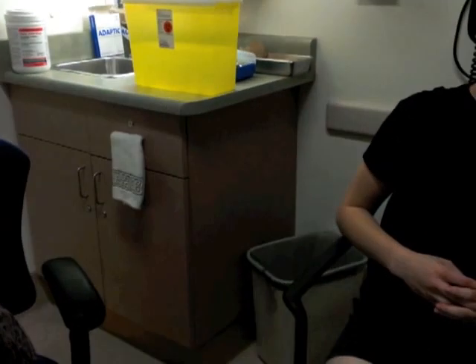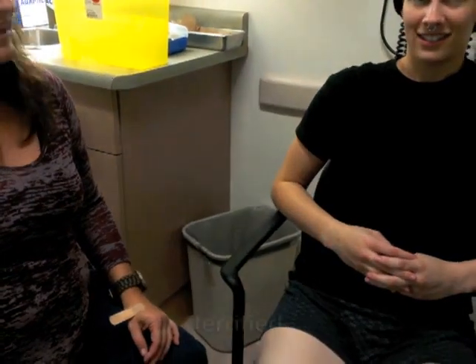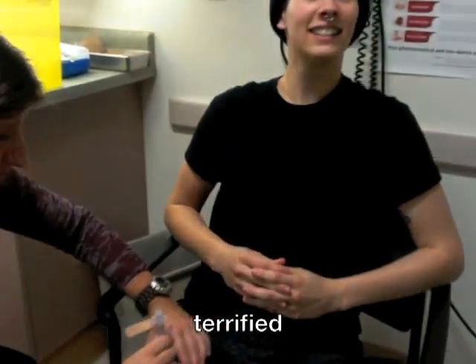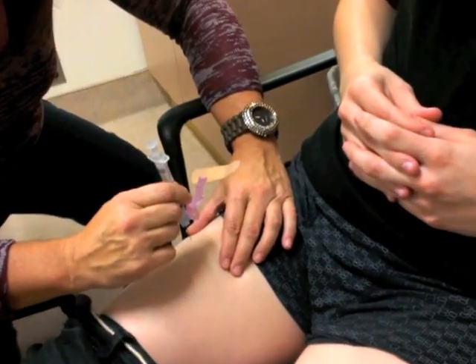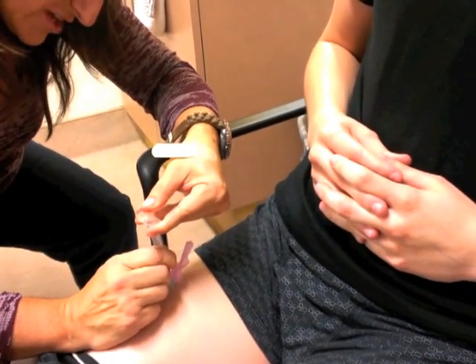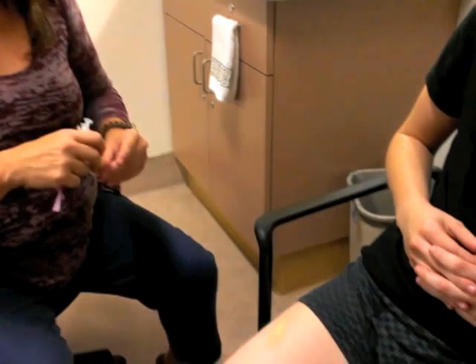Look at all the tricks of the trade we're learning. Okay. It's good. And then just consider this like a dart. You're not playing darts, but just that analogy of throwing a dart. You want to do it at 90 degrees, so you're going to be going really quick. You're going to go 1, 2, 3. Take a deep breath. Keep on breathing. And you're going to withdraw on the plunger to make sure there's no blood. And then you're going to slowly inject. You're going to take it out. Wow, that was nothing. I barely even felt it.